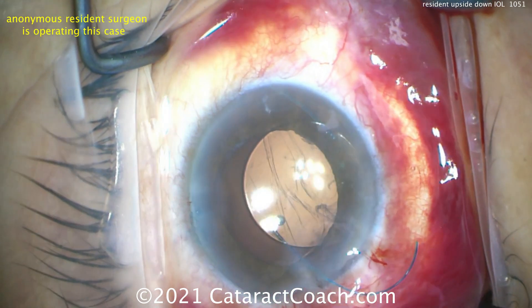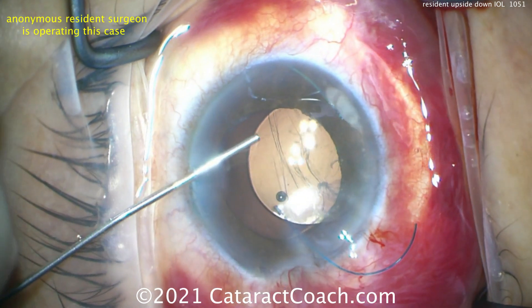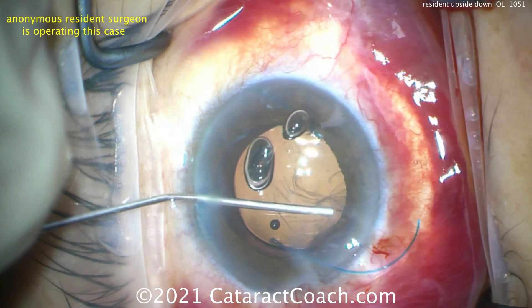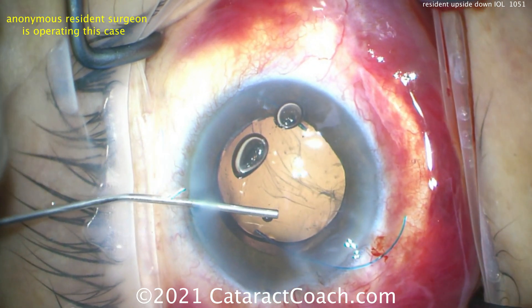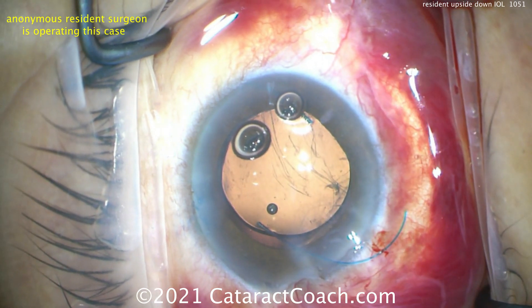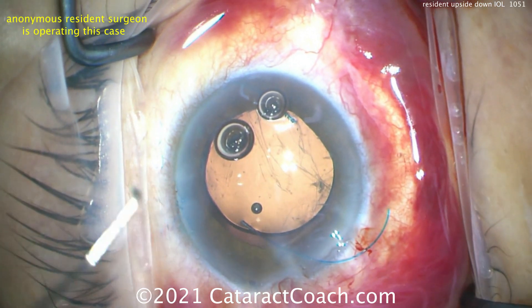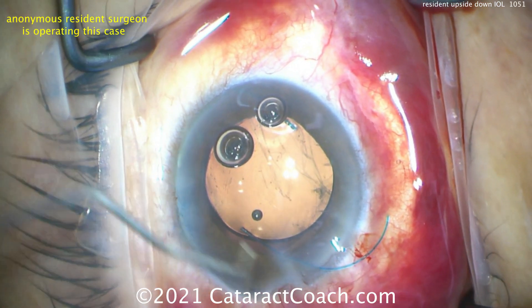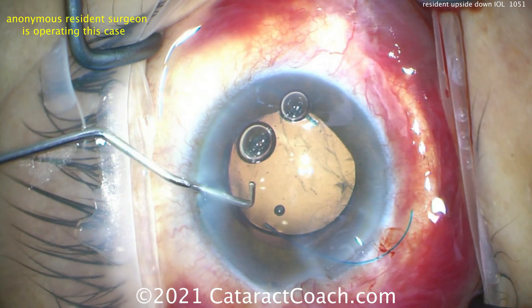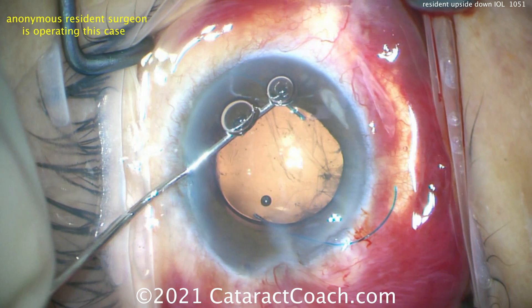There you see the posterior capsule is open — let's be honest about this, no denial. Those wrinkles are not just wrinkles; those are ruptures. But the anterior hyaloid face is intact. Let's put more viscoelastic in, get the lens centered, and put the lens in the sulcus now. The patient will be fine — the haptics are now in the correct orientation, the lens can be dialed into the sulcus, and this patient in the post-op period had a nice outcome.